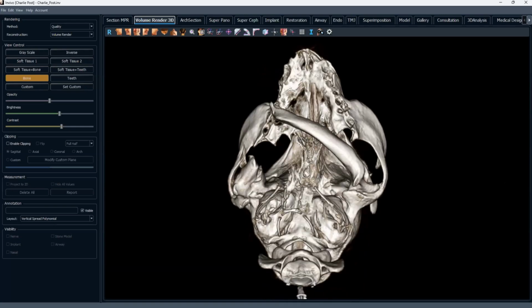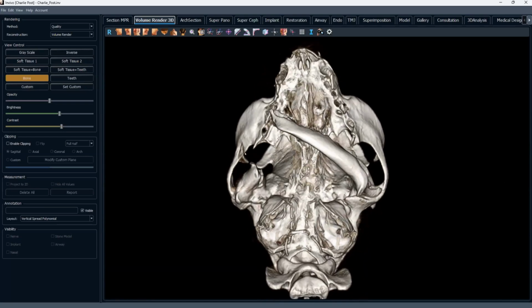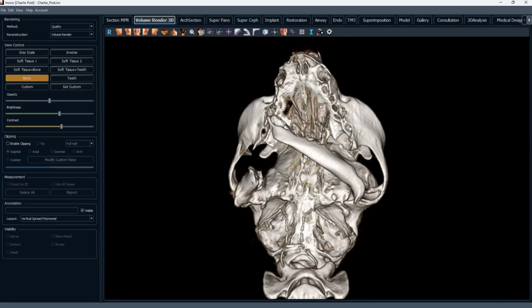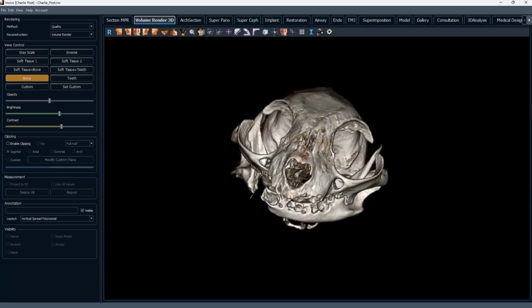My original plan was to kind of cut more perpendicularly, but because of the soft tissue and his cheeks and things like that, the access was much more difficult. I had contemplated doing a commissurotomy, but I really didn't want to make any more soft tissue holes in this cat than we already had, and so we were still able to get that completely intraorally, and then just had to deal with a small, almost vestigial mandibular artery after the piece came out, and then completed the extractions and put everything back together.